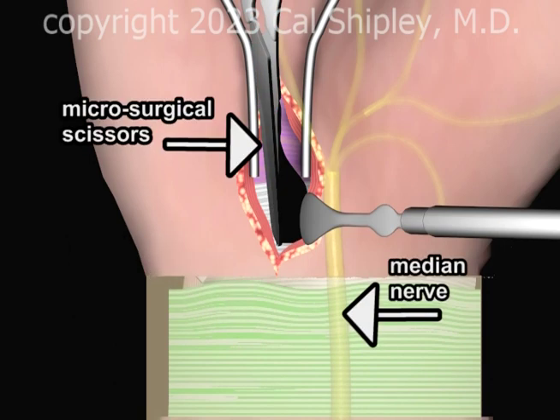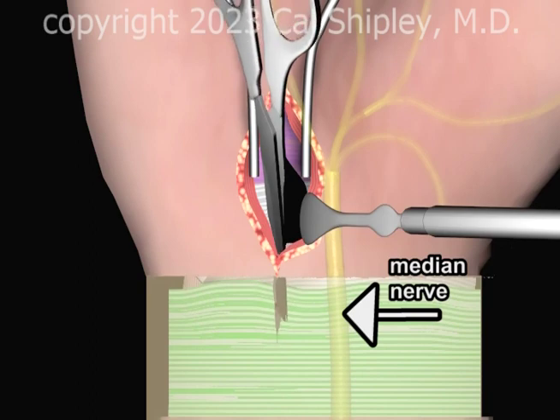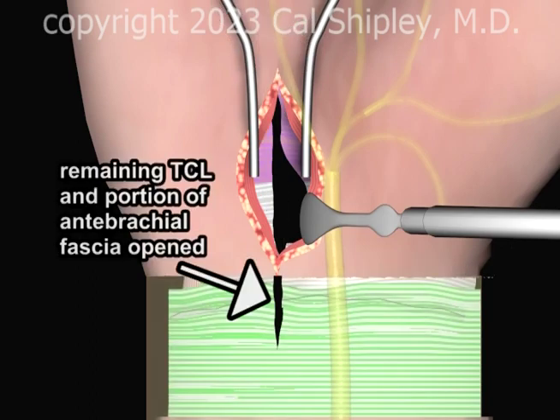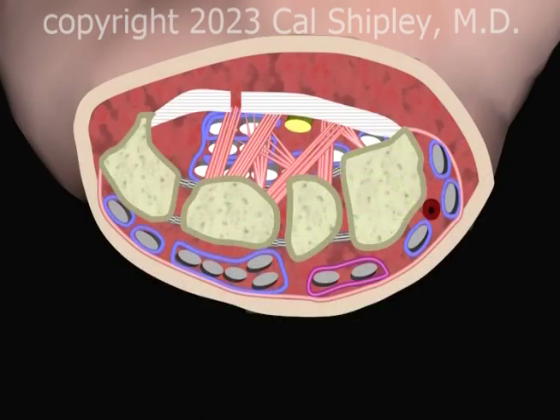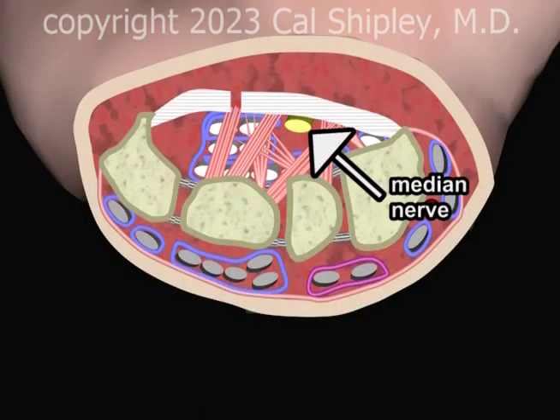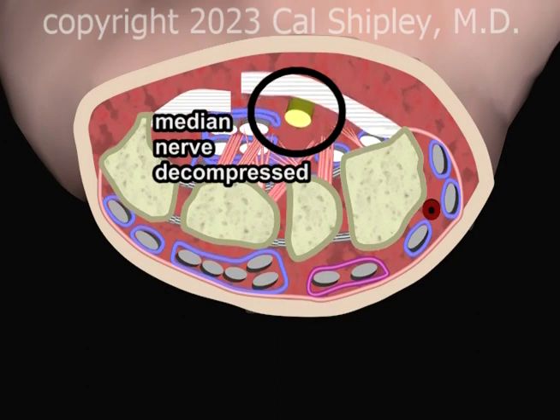Microsurgical scissors are again employed to open up the remainder of the TCL and the distal portion of the anti-brachial fascia. The distal flexor retinaculum, the transverse carpal ligament, and a portion of the anti-brachial fascia have now been opened. As a result, pressure within the carpal tunnel has been reduced and there is significant decompression of the median nerve.